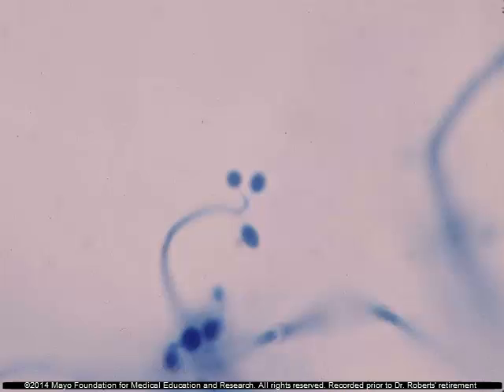Here you see microscopically how it produces the spores, or the conidia. The conidiophore is a very short, kind of curved, very delicate structure. And at the tip, there's a little thing that protrudes out that is the apex where the spores are produced, like a little connection to the top of that thing, a very, very delicate connection. They go back and forth in terms of producing conidia. Hard to see unless you use something like oil immersion because the spores are so small. But they're produced in that zigzag fashion, and that's what Beauveria looks like.